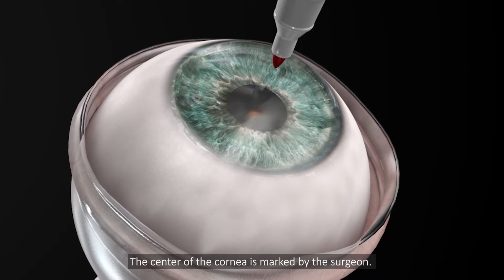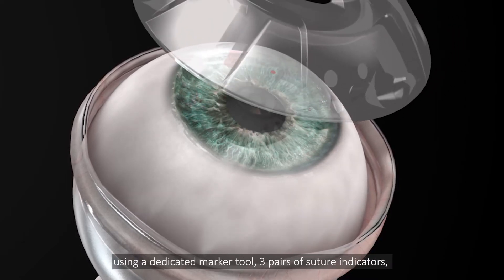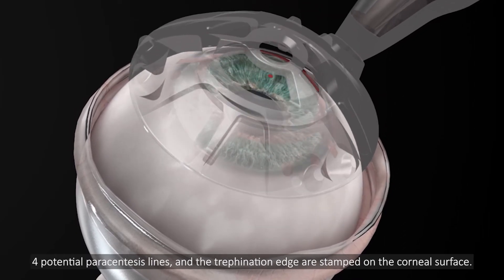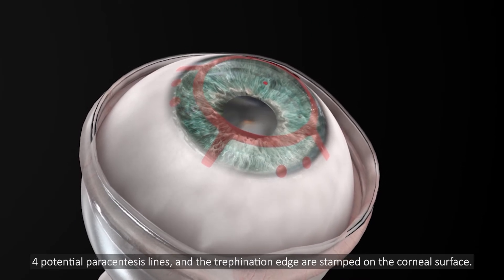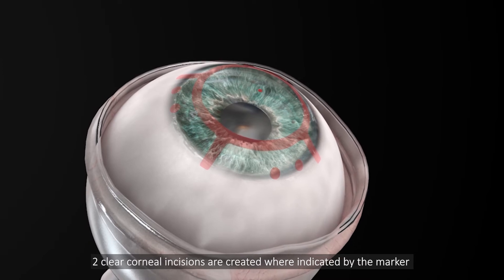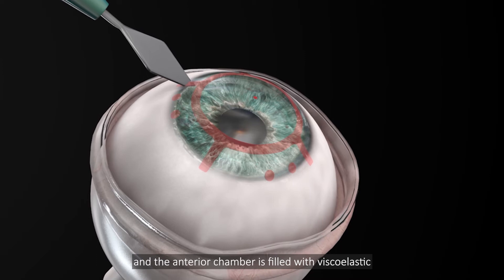The center of the cornea is marked by the surgeon. Using a dedicated marker tool, three pairs of suture indicators, four potential paracentesis lines, and the trefination edge are stamped on the corneal surface. Two clear corneal incisions are created where indicated by the marker, and the anterior chamber is filled with viscoelastic.